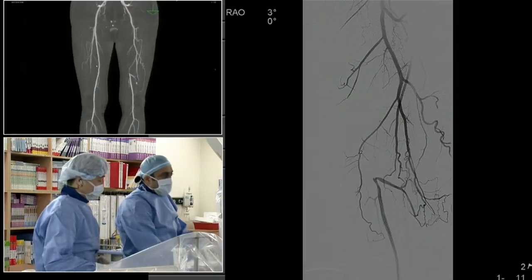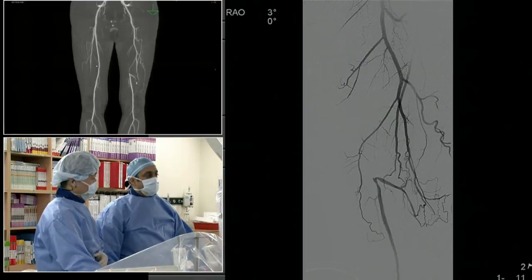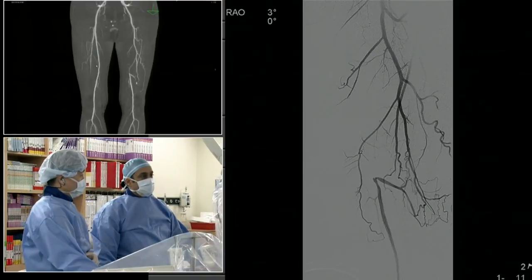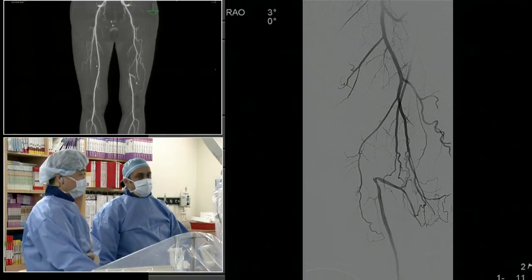What would your thoughts be about atherectomy if you were confident that you were subintimal the majority of the way? Yeah, I think that's always a big problem, particularly as you're probably going to be crossing this in the subintimal plane. I think getting a reasonable lumen is the intent here, rather than really trying to debulk beyond a 50% residual plaque volume. And if you can get that, even with a subintimal approach, you probably have a fairly good chance that you will not create a major perforation. Again, back to DEFINITIVE, the biggest complication rate was perforation at about 5.4%. So I think that definitely needs to be stated, and your point is well taken.